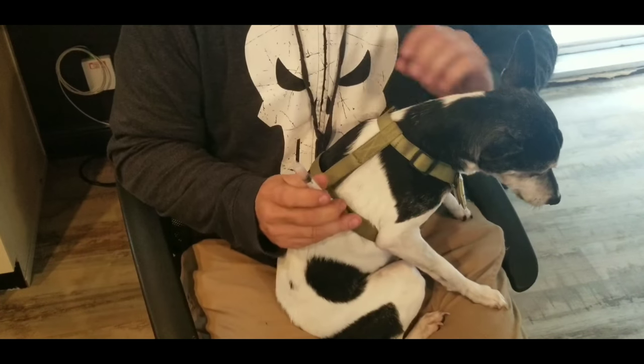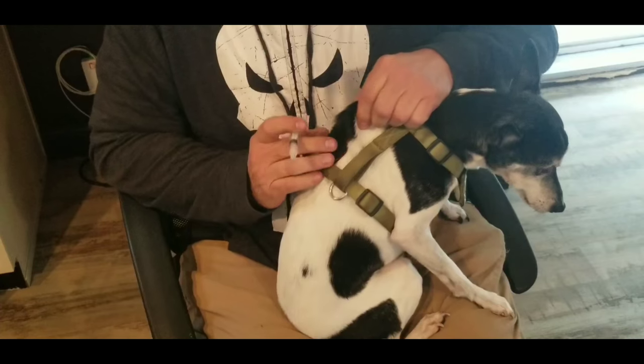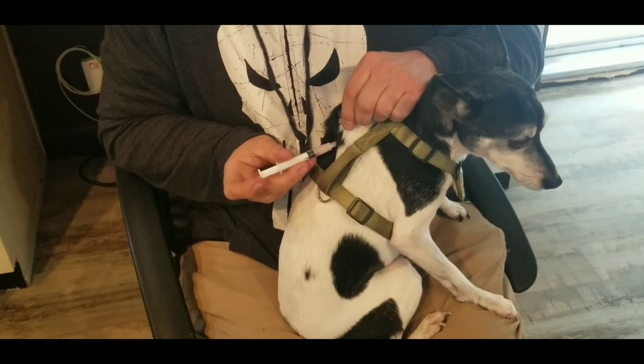This generally does not hurt the animal. You pull their skin up like this, and you see the little indention here. You do not put this into muscle — you put it right there, and the shot is done.